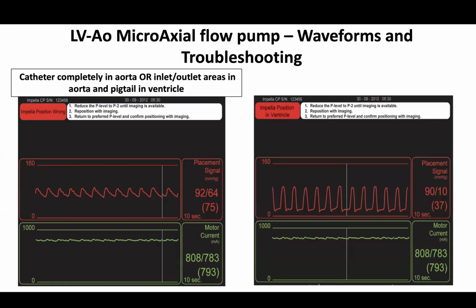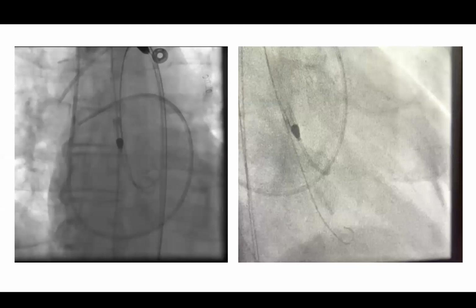So what's going on here conversely? You get superimposed LV pressure, both in the aortic sensor and the LV calculated tracing. So this is something that you could do at bedside, right? This is different. So this is that case, right?